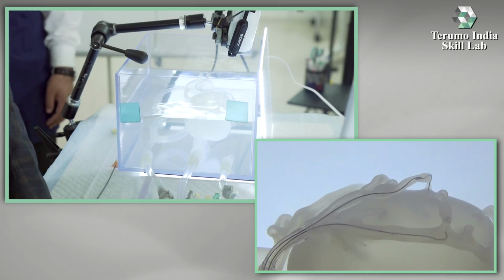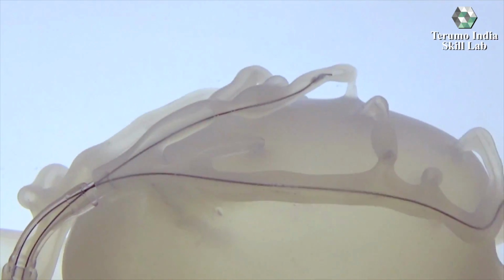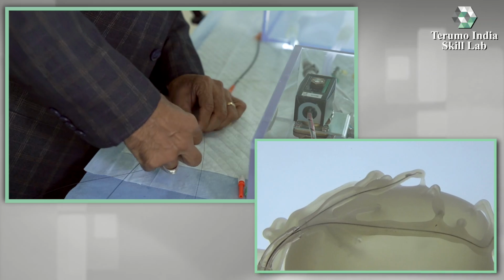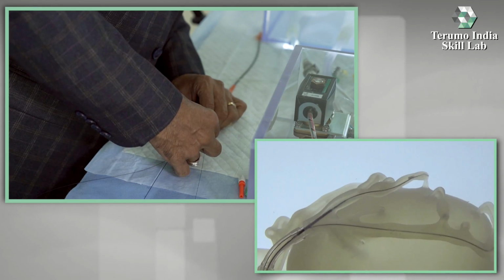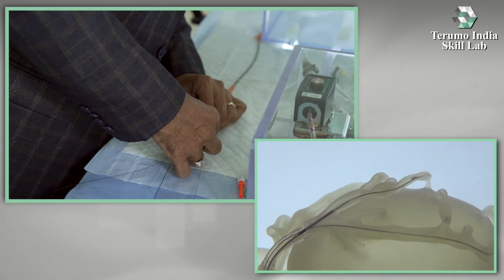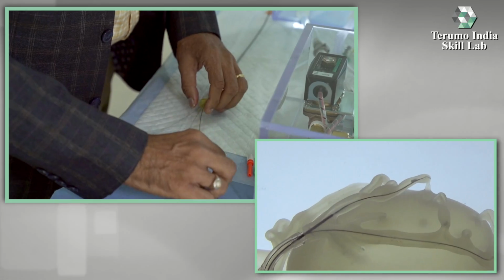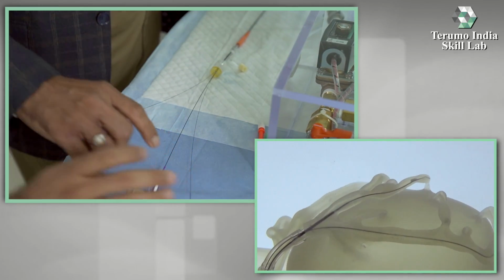Okay, so the wiring is in place. Perfect. So we are in the branch. Okay, we are in the branch, and now we need another balloon to be kept in the LAD.